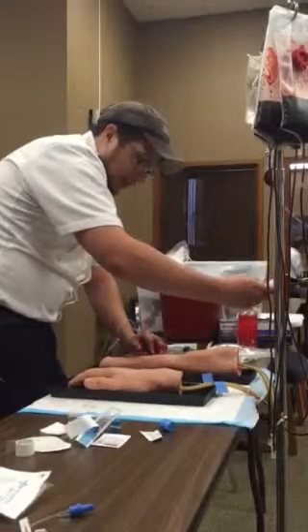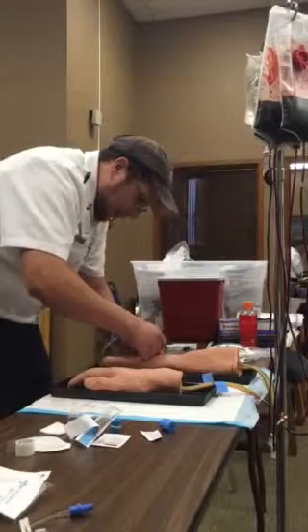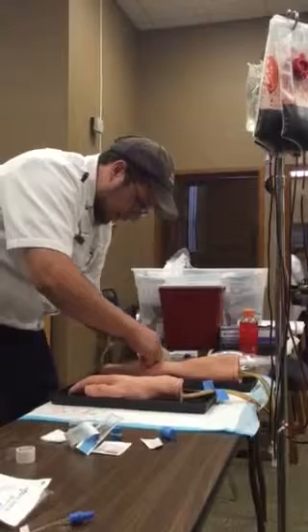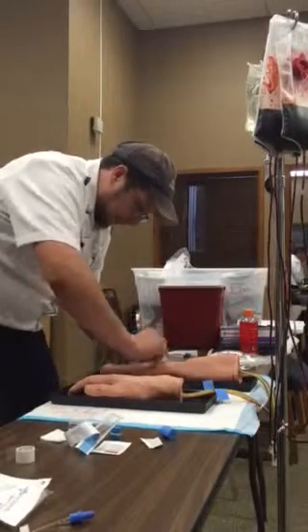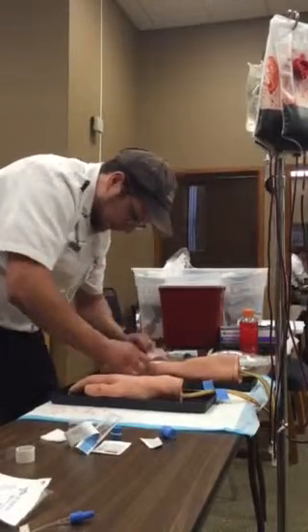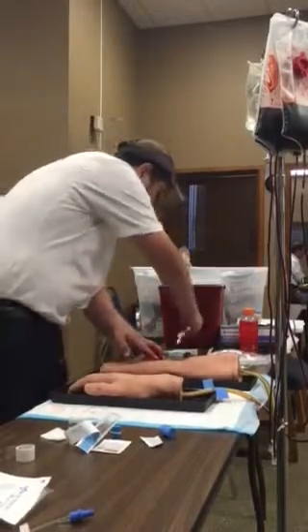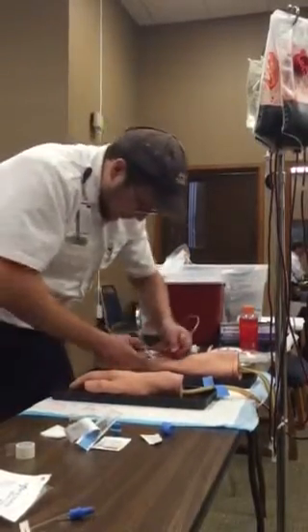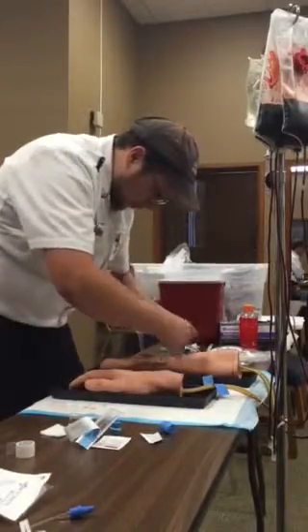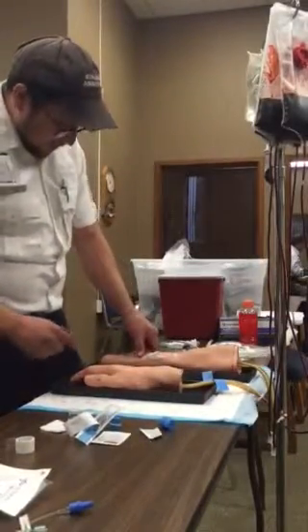Yeah, I'm going to bring it back down to TKO. You still have TKO flow. I'm going to secure my line using tape and some Tegaderm. Secure the rest of my line. Alright, line is secure. You're still treating a 60-year-old bradycardic male.